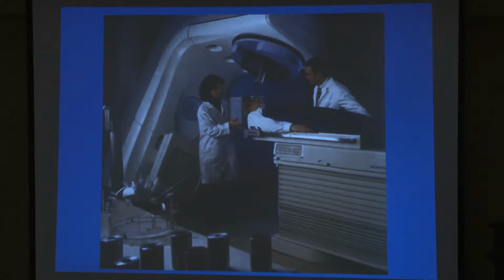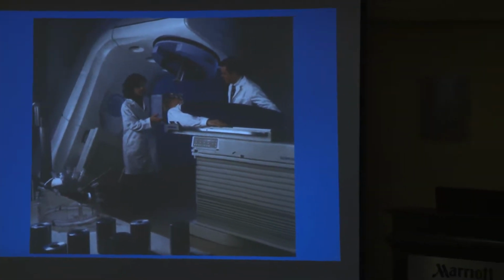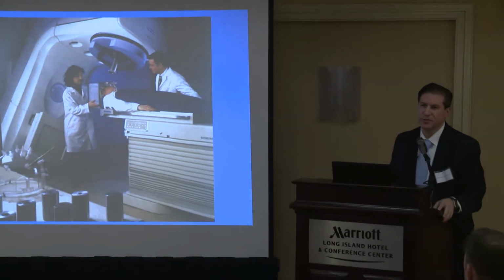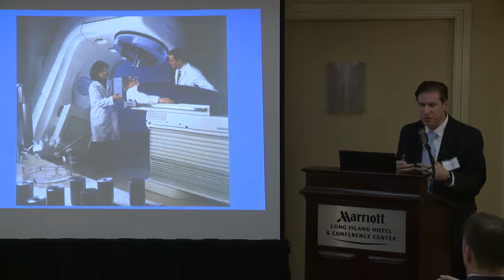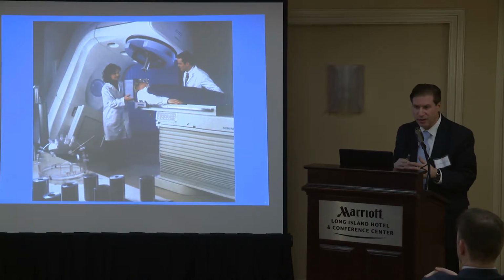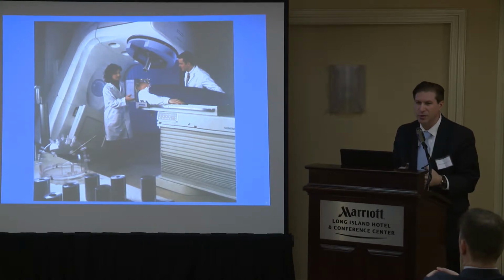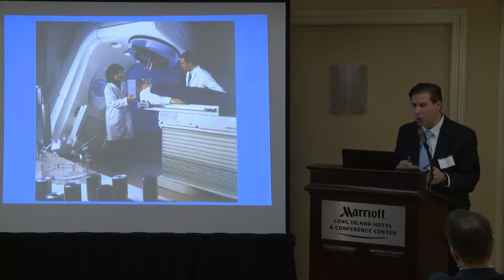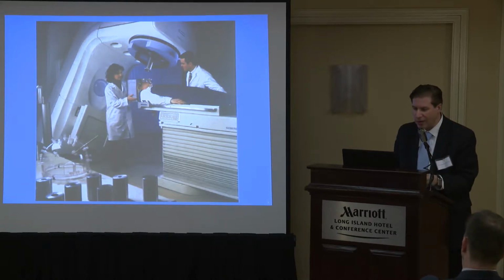And by the way, I'll also say the stereotactic brain radiosurgery, the team of people that are involved is a neurosurgeon, a radiation oncologist, and a physicist. For standard radiation delivery, it's just a radiation oncologist and physicist. As far as I'm concerned, the neurosurgeon's participation is critical. We're treating a lot of diseases, including a lot of benign disease, that is not normally treated by radiation oncologists. We also have a sense of when does the person need surgery? What are the critical structures? There's a lot that we bring to the table, and I think it is critical that neurosurgeons be intimately involved and have a leadership role in brain radiosurgery.